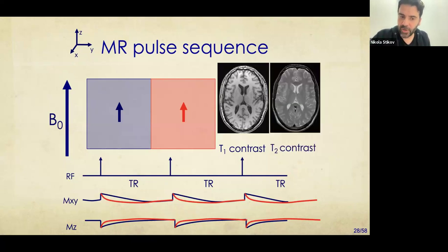But there is also T2 contrast. T2 contrast is concerned with the transverse magnetization, which is the MXY. And there you will see that the water, the ventricles, actually appear bright. The reason they appear bright is because water also has a very long T2 time. Now, if the T2 time is long, then for the magnetization, it takes a very long time to decay. So it's kind of more like the blue over here. And therefore, we'll be able to image it and get some signal. Unlike the water, the gray and the white matter are slightly darker. That is because they have shorter T2 times.